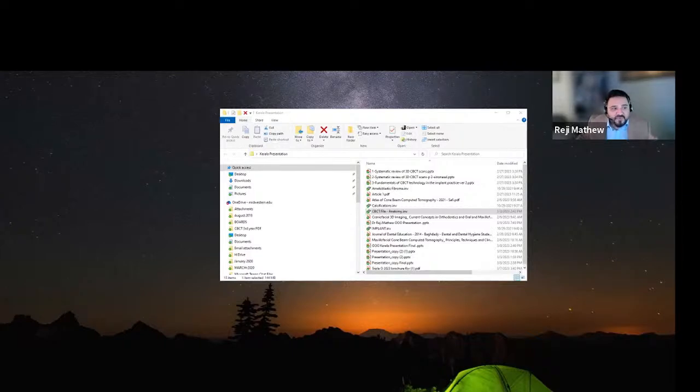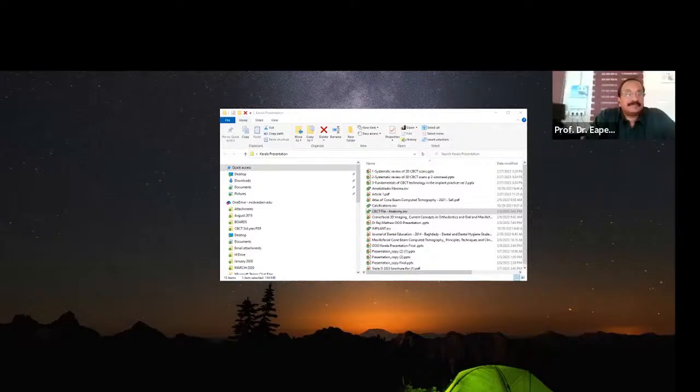And the second one is carotid artery calcification, which you see at the C3, C4 level. On a CBCT, anything and everything you probably will be able to miss. The maxillary sinus is important. You don't want to miss anything in the maxillary sinus. You want to see the maxillary sinus ostia clearly. If there is near complete obliteration of the maxillary sinus, I would refer to an ENT.